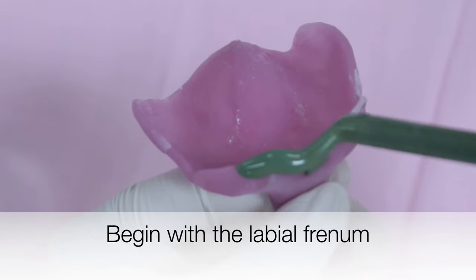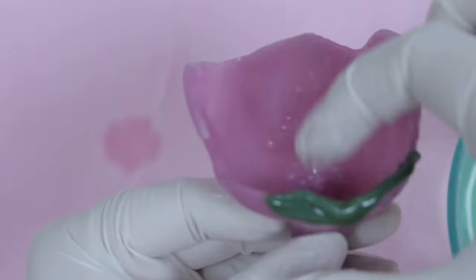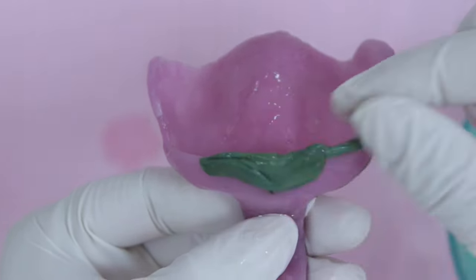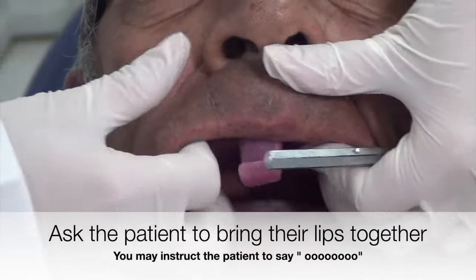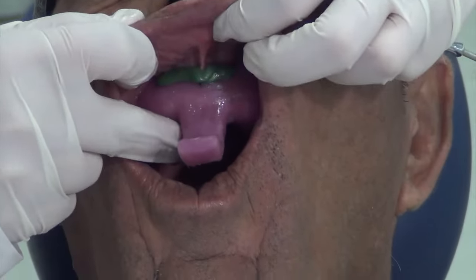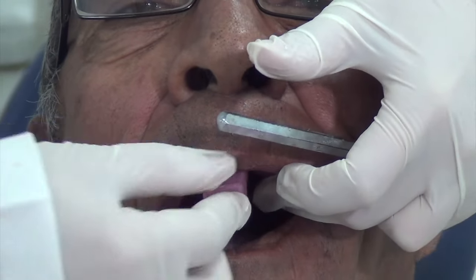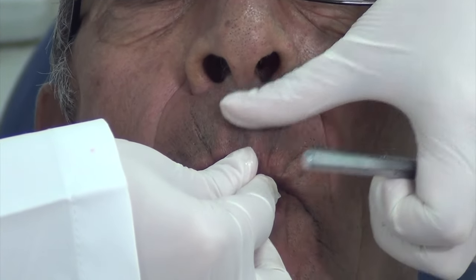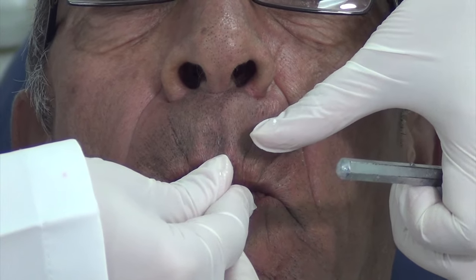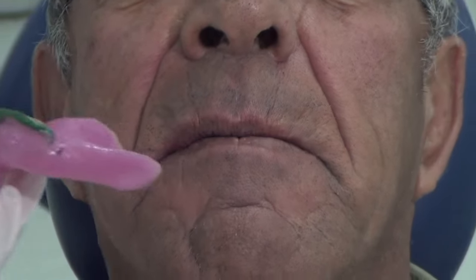Start with border molding the labial frenum. Place the compound on the tray approximately two millimeters short of the full depth of the sulcus or the denture borders. After placement of compound, position it beyond the expected height of the vestibule. Heat it, temper it in hot water, and then place it in the mouth. Move the lip in an upward and downward direction to border mold the labial vestibule and the labial frenum. Then ask the patient to seal their lips around the handle of the tray, which will activate the orbicularis oris and record the full depth and width of the labial vestibule.